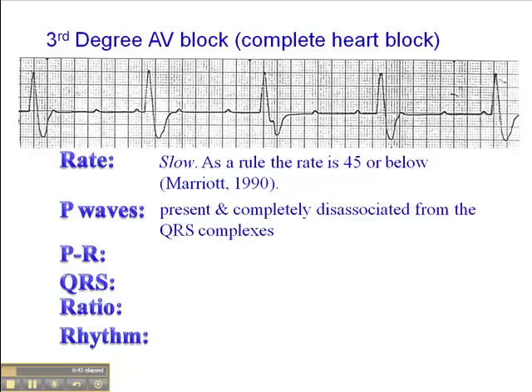P-waves are present, but they're completely disassociated from the QRS complexes, and this is really the hallmark of third-degree AV block. The P-waves map out and they're equidistant — but they're also equidistant in second-degree AV block type 2. The difference here is that periodically you'll see the P-wave alter the QRS morphology because it falls right in the middle of the QRS complex. The P-waves are equidistant and they march right through the QRS, altering the QRS morphology.